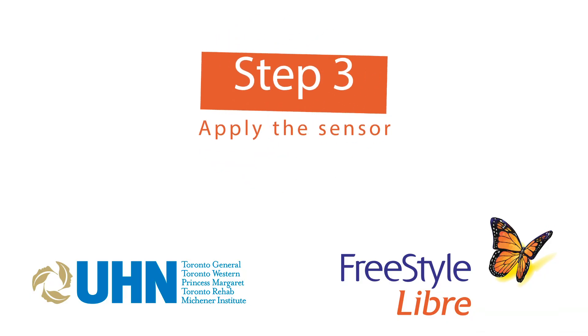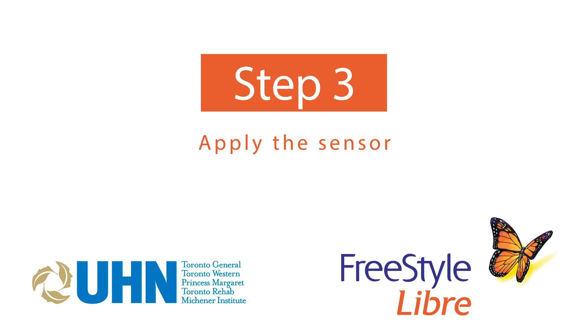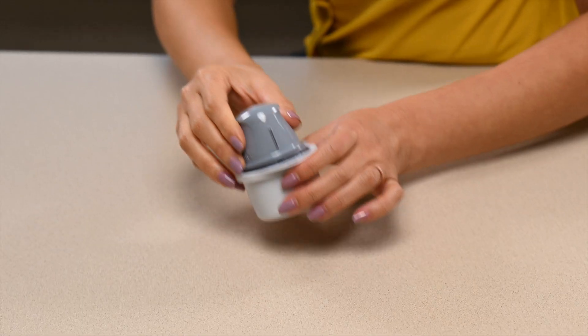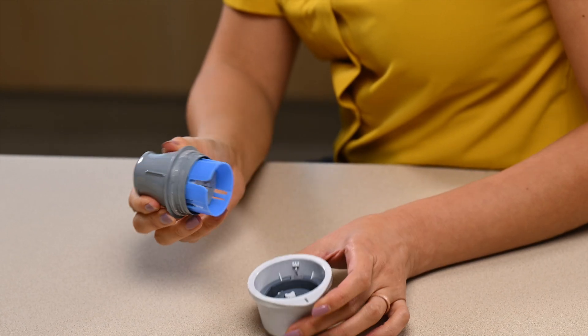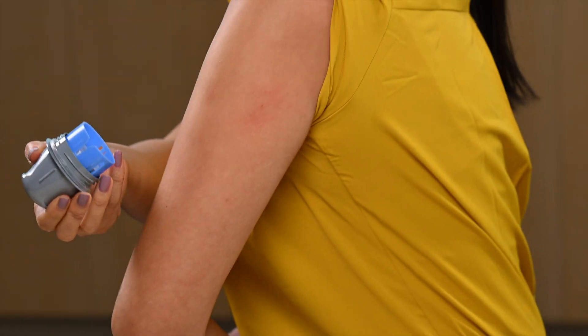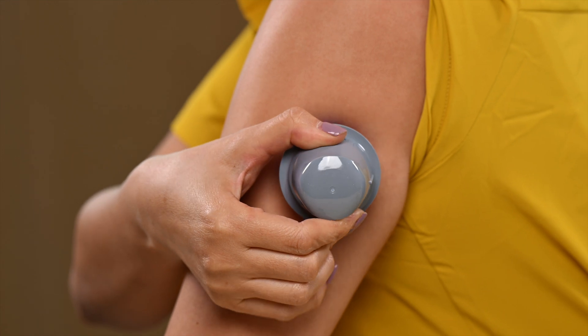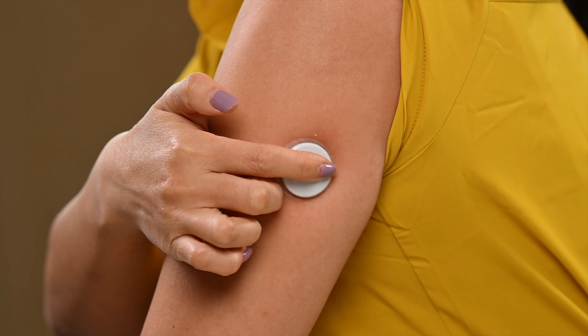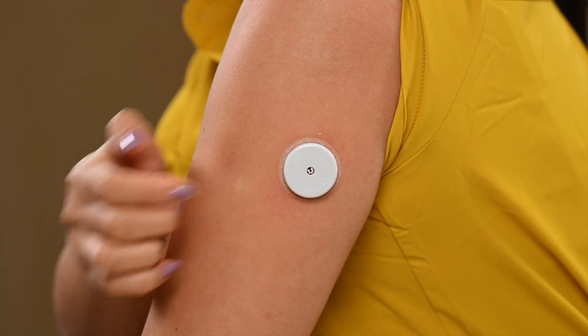Step 3: Apply the sensor. Take the applicator off the sensor pack and press it firmly against the chosen spot. Press until the sensor is in place — you will hear a click when the sensor is in place. Carefully pull the applicator away from your arm. Gently press around the sensor to make sure it's secure.